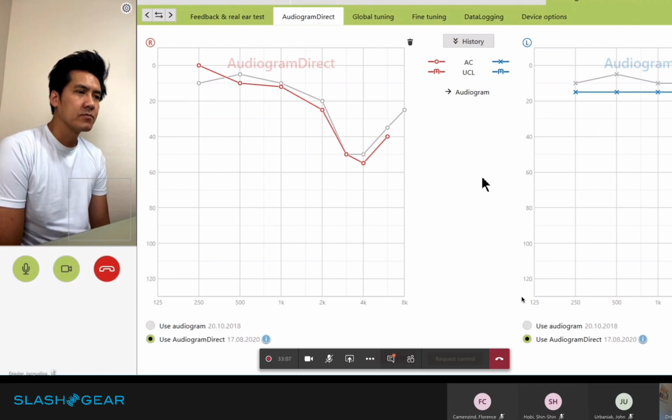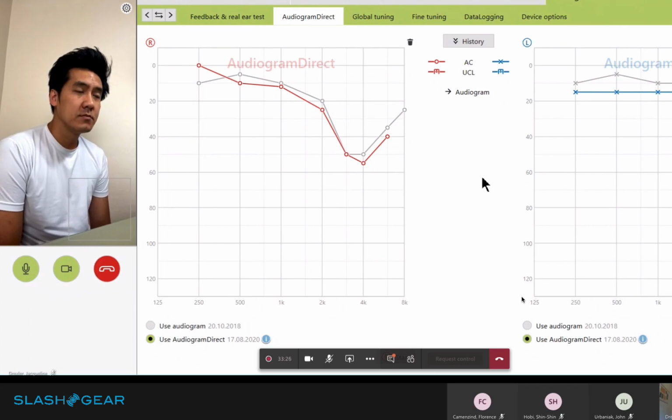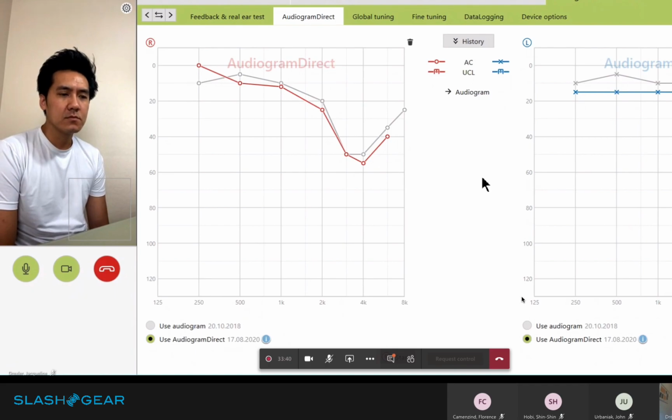So then the next thing I would do is talk to you about how you've been doing in your listening situation. So I did the earpiece. And the earpiece would generally be better addressed in clinic to make sure the fit is appropriate, or we would discuss a custom earpiece. But when you're in your daily listening environment, how are you doing when communicating in quiet, when communicating in noise? How has that experience been for you?